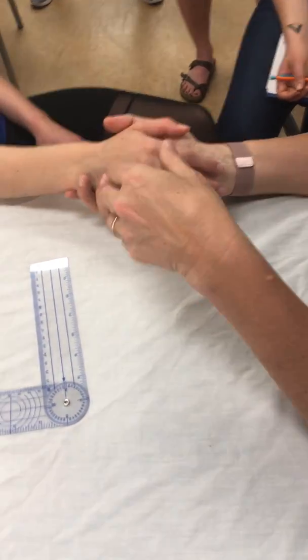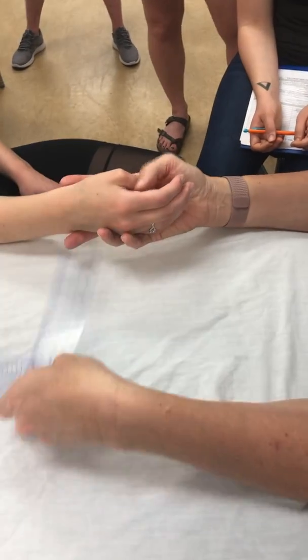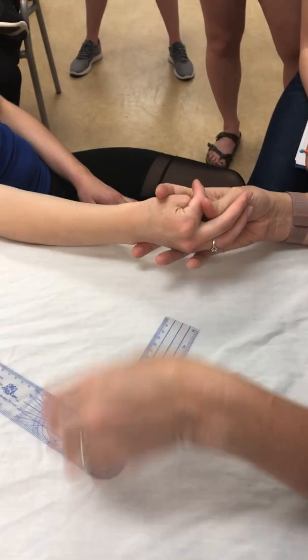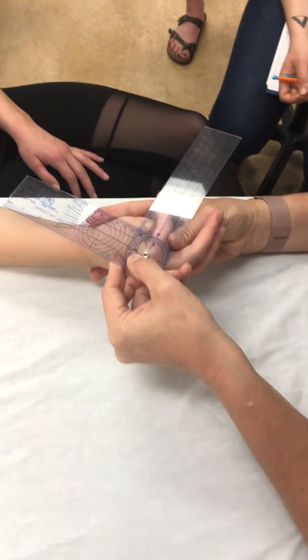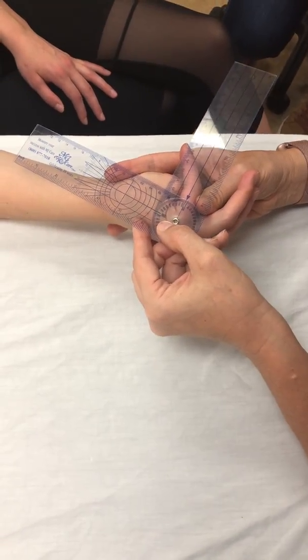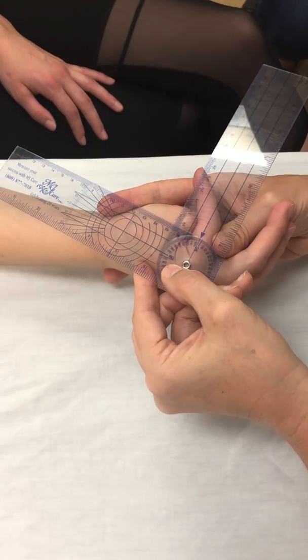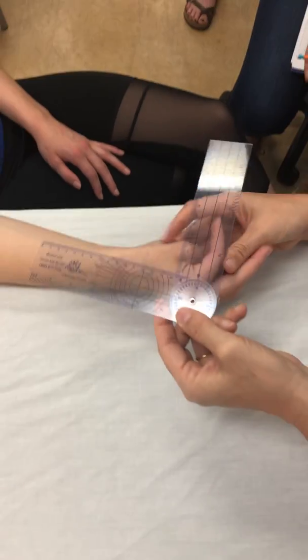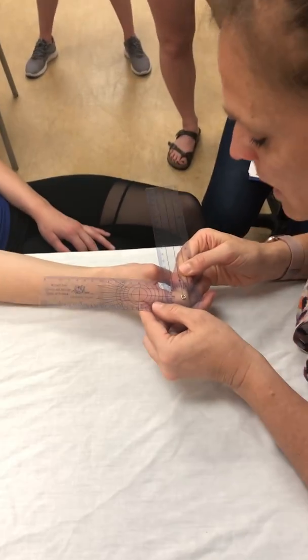Okay. So if I was going to measure MCP flexion, sorry, get your thumb out of the way. We're going to do the same thing. We're just going to put the stationary arm on the metacarpal. We're going to put the moving arm on the proximal phalanx. The axis is right over the joint. Okay, and I can then go up to the proximal interphalangeal joint.